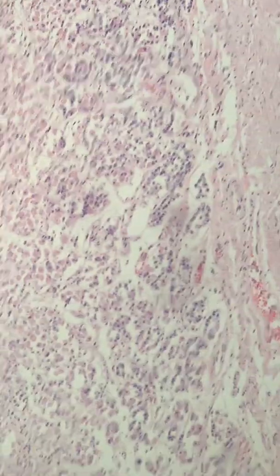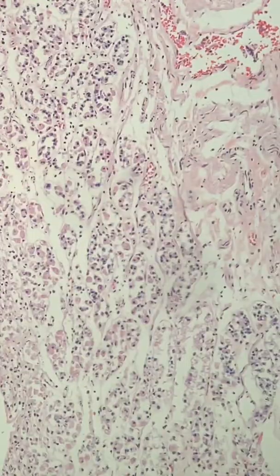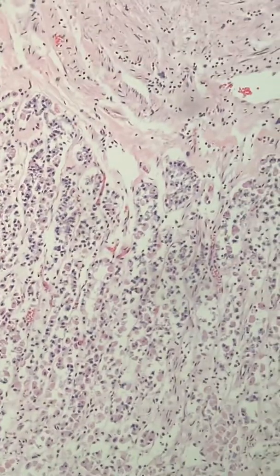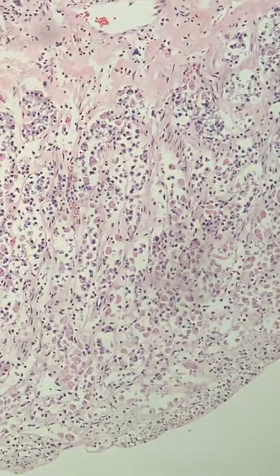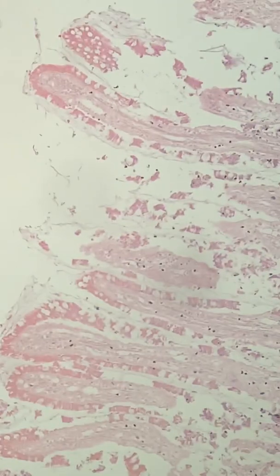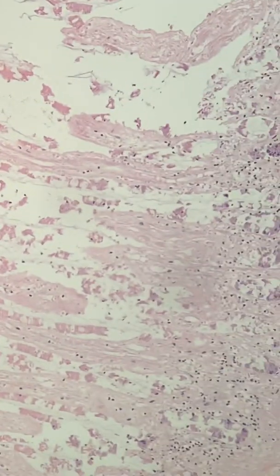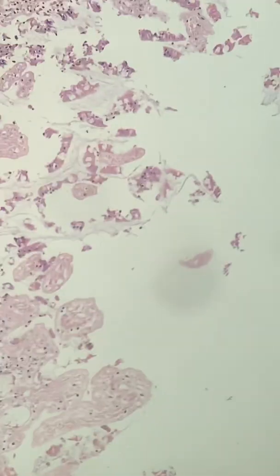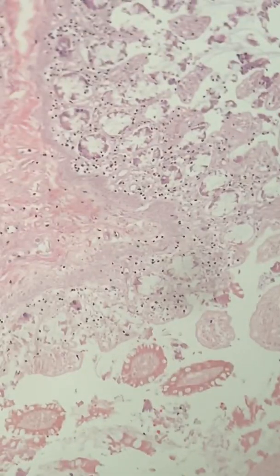Very normal looking stomach. This is the fundic portion of stomach. Probably a little fundic/antral portion of stomach. But very normal looking stomach here as I continue to peruse. Here's a section of small bowel. You can see the tall leaf-like villi, very normal. Obviously, autolysis going on here because, again, the person was dead and you'll start seeing some dying of the cells. But you see there's not much in the way of inflammatory pathology here or even neoplastic. Very normal, nice-looking small bowel villi. Very normal.